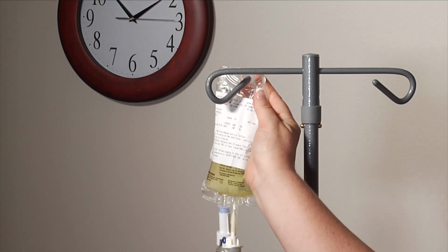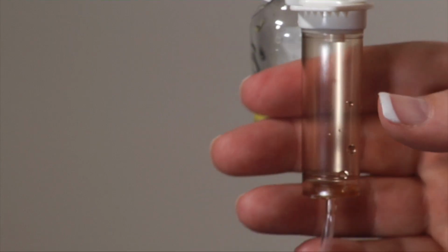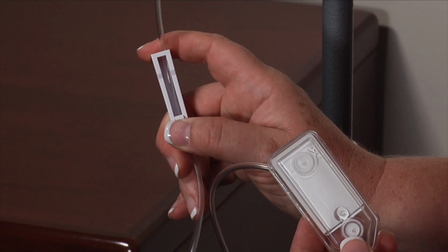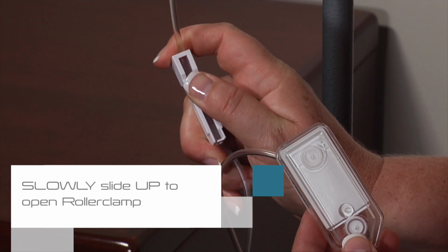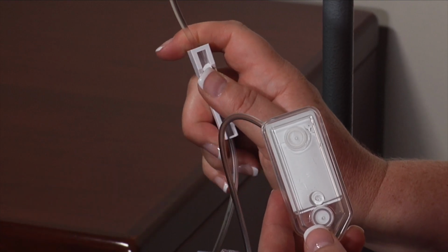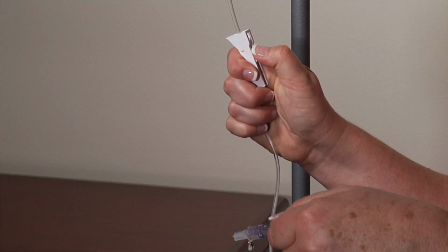Hang the medication bag on the IV pole. Squeeze the drip chamber, filling it half full. Prime the entire length of the tubing with medication by slowly opening the roller clamp and inverting the filter until the tubing fills completely with fluid. When a droplet of medication is noted at the end of the tubing, close the roller clamp.